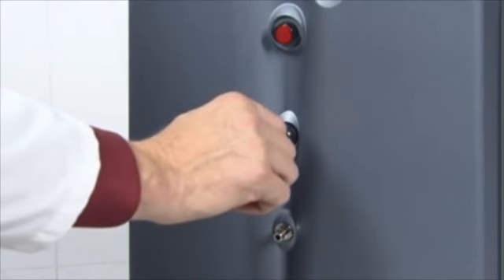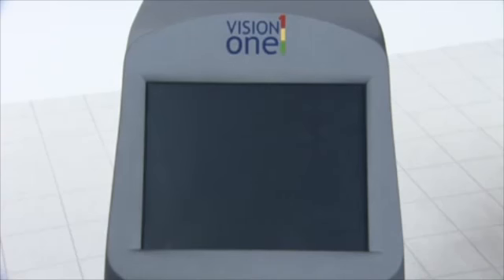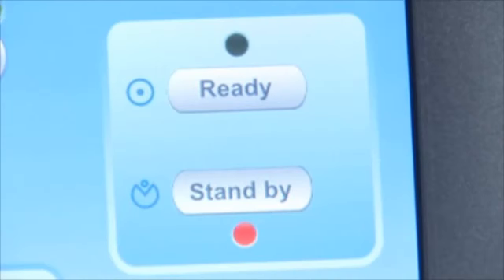Insert the key into the key switch and turn the key to the on position. When the laser is turned on, a self-test and warm-up begin. The self-test and warm-up take approximately 1 minute. When the self-test is successfully completed, the treatment settings that were last used before the laser was turned off display on the control screen and remote control, and the laser defaults to standby mode.